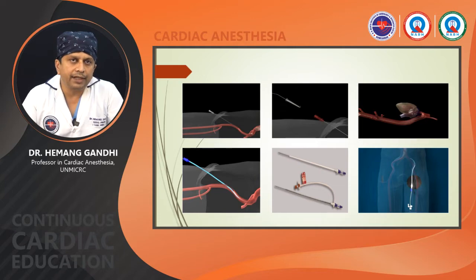And after this dilatation, either you use the sheath to insert the balloon, or you can also directly insert the balloon as a sheathless balloon. In our institute we commonly use the sheathless balloon. Very few indications where we are using the sheath for the balloon insertion.